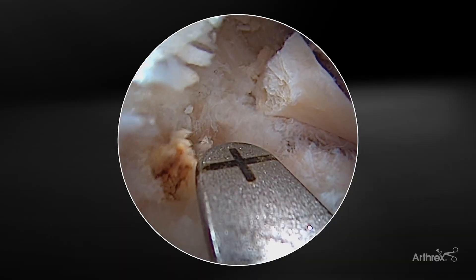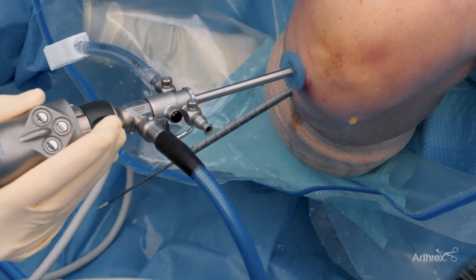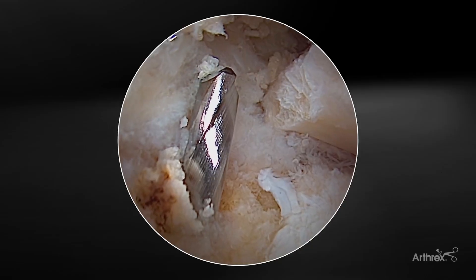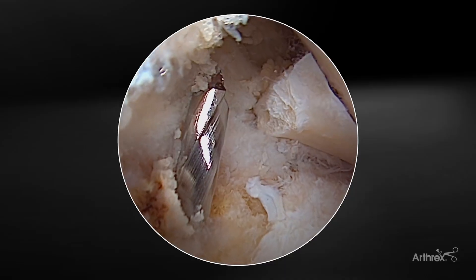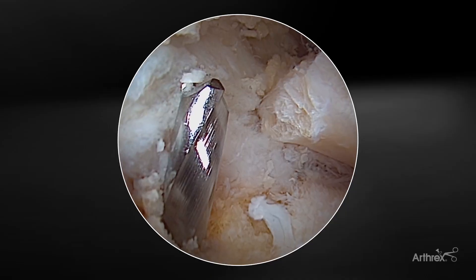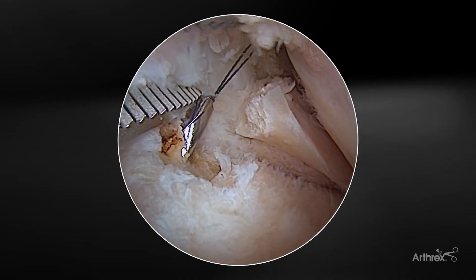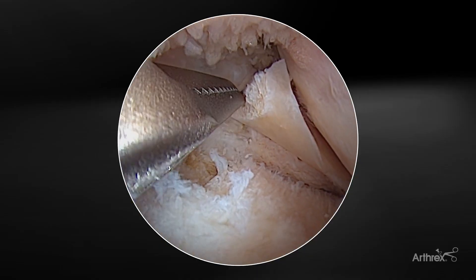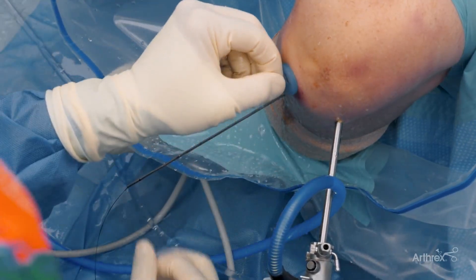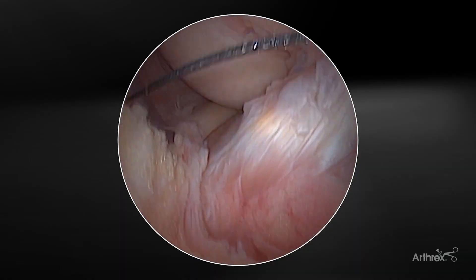One helpful technique when setting the meniscus point-to-point guide is to gently tap the 2.4mm sheath with a mallet in order to fully set it up against the tibia cortex. This minimizes deflection of the 2.4mm drill pin. The meniscal point-to-point root guide is then removed. One thing to keep in mind is that in hard tibia bone, occasionally the center drill tip may slightly become disengaged from the outer drill. If that's the case, you can redeploy the center drill tip and re-drill to make sure you get it fully deployed. It can also clean out any bone at this orifice so that you can easily pass the nitinol wire. The nitinol wire is then inserted and grasped through the knee in the medial portal through the passport. You may have to switch portals with the scope to get the right trajectory to grab it, but in this case we're able to get the nitinol wire pretty easily through this cannula.